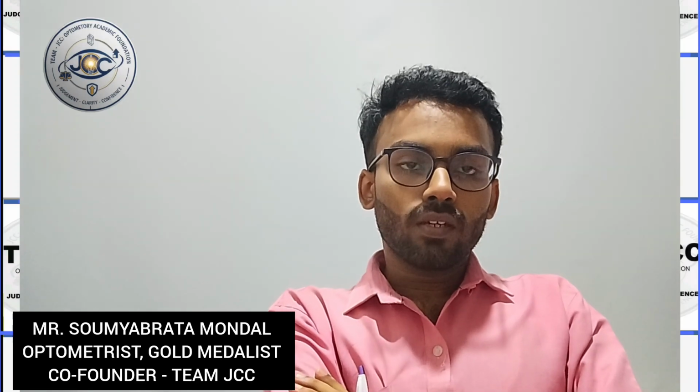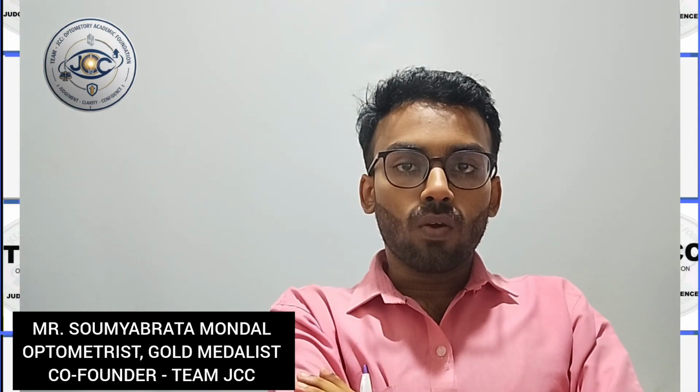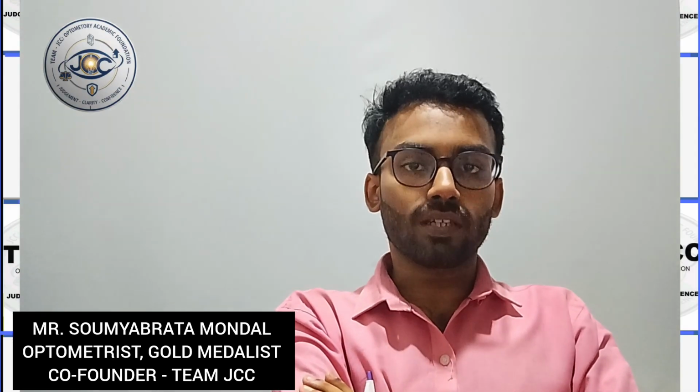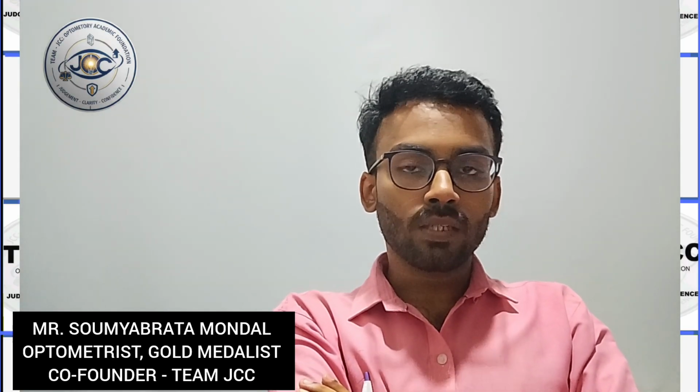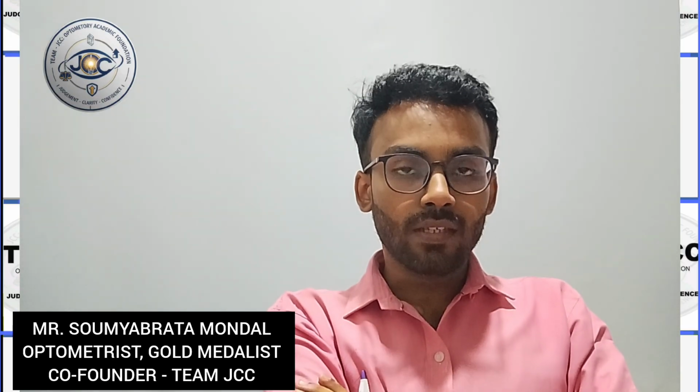Today we are going to learn about some basics of ocular coherence tomography and its interpretation. To know about retinal disease, the pathologies and the pathophysiology, you have to go through the different layers of the retina in the normal state and in the pathologic state, isn't it?